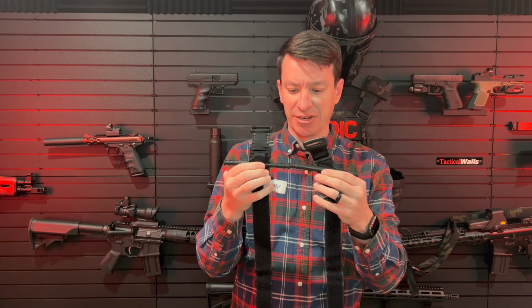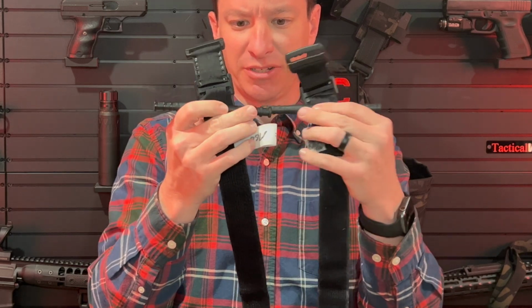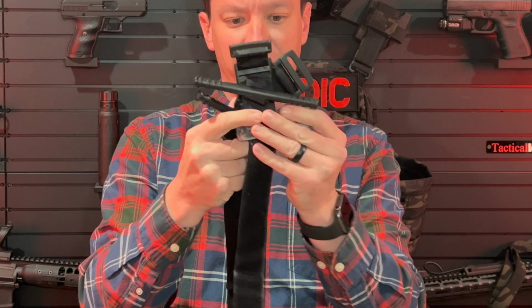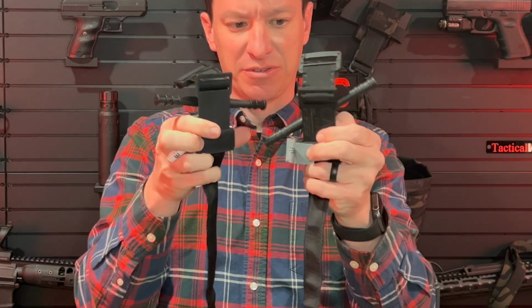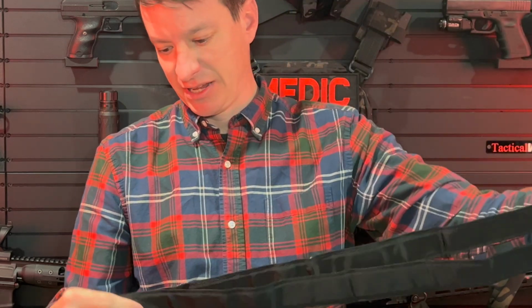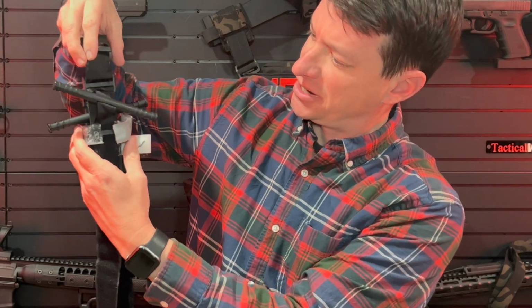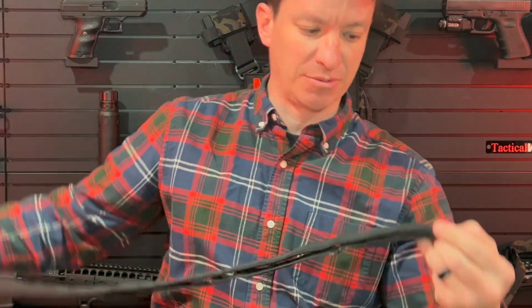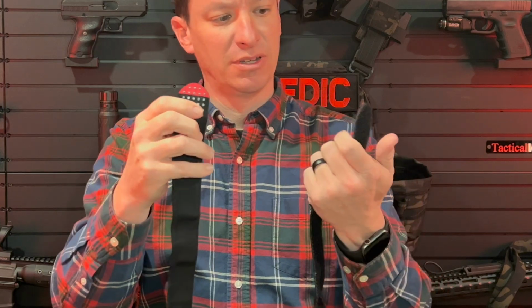So if we take a side-by-side comparison here, you see the windlasses actually look pretty close. There are some differences there: two notches, only one notch, and then it goes three. But right here on the tip, you can see there is a difference. Come down, and we have a white tab versus a gray tab. The back is what I was talking about here. You can see CAT on this one, smooth here. They're the same length. You can see a little bit of difference in the base plate, like how it's made, and then you can see the difference in the red tab. So this one over here is the fake one. This one over here is the real one.